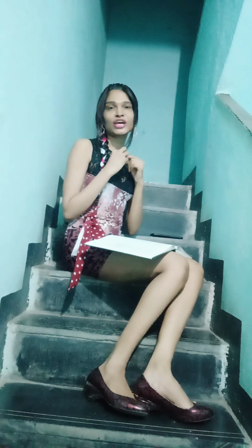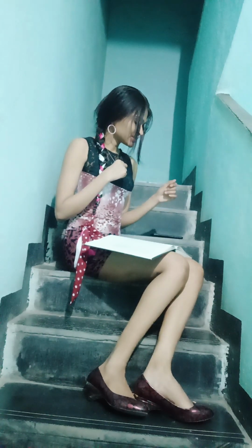Direct contact lenses have an anterior curvature steeper than the anterior curvature of the cornea, but they have a refractive index similar to that of the cornea. And in indirect gonioscopy, the lenses we use are called gonioprisms, prisms because they have that mirror which reflects the light rays.